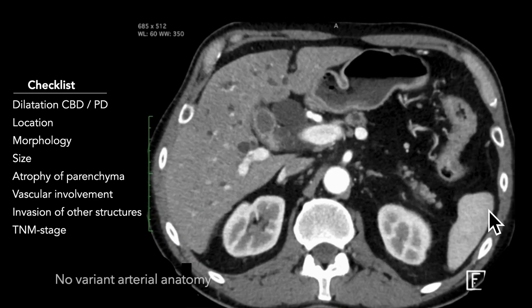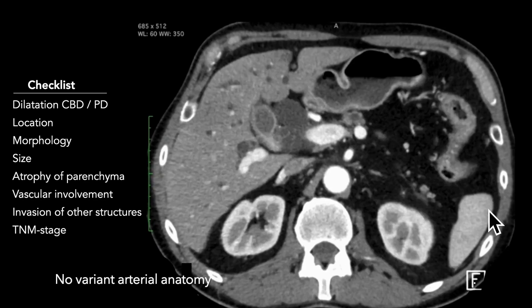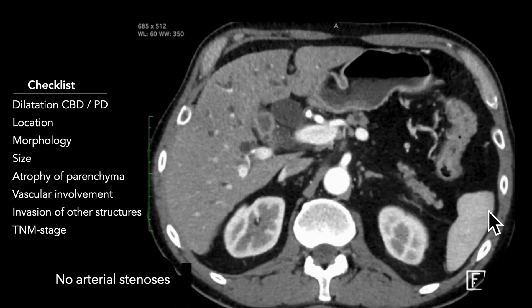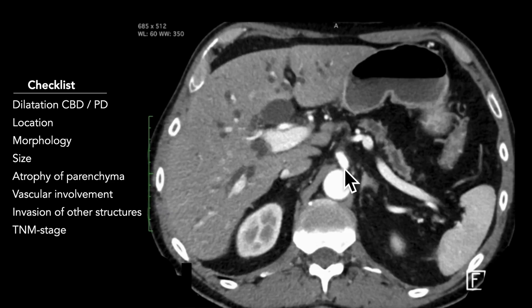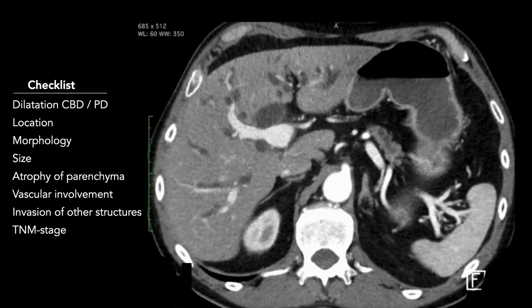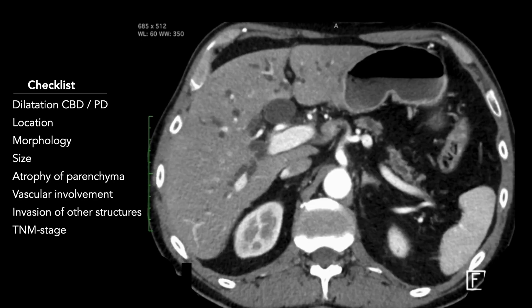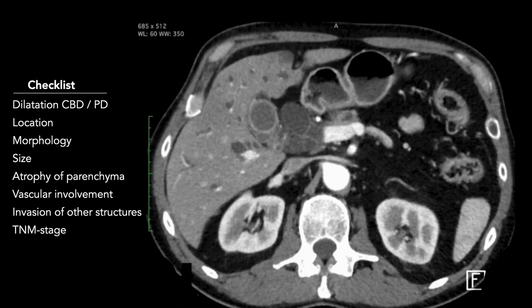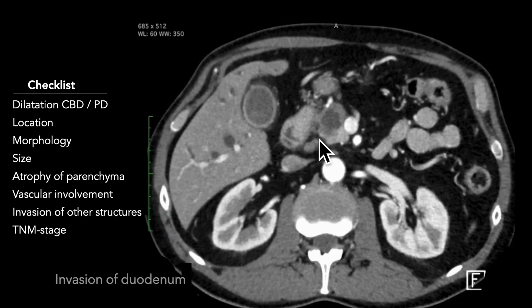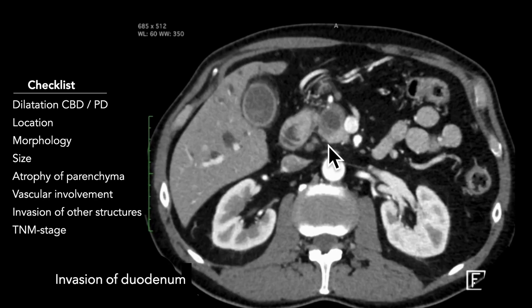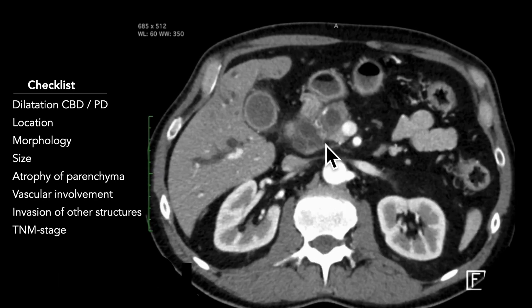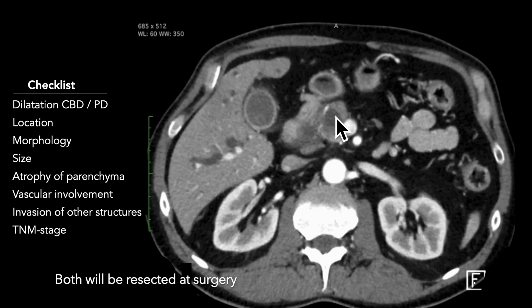Regarding vascular anatomy: normal. No stenosis of the SMA and no stenosis of the celiac trunk. In addition to the vascular involvement, there is invasion of the peripancreatic fat on the lateral aspect of the pancreatic head towards the duodenum, encasing the gastroduodenal artery.